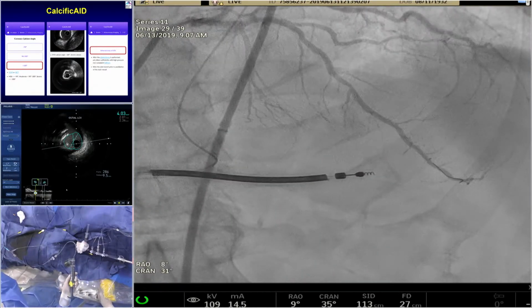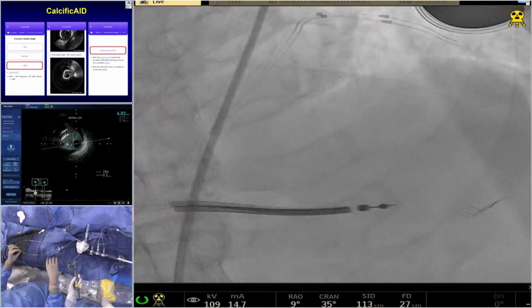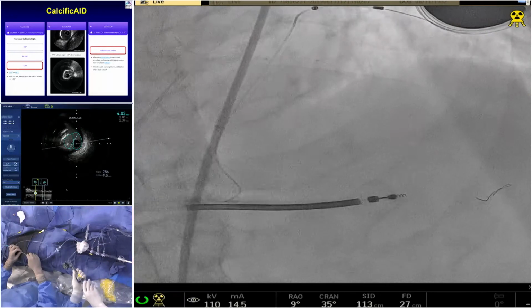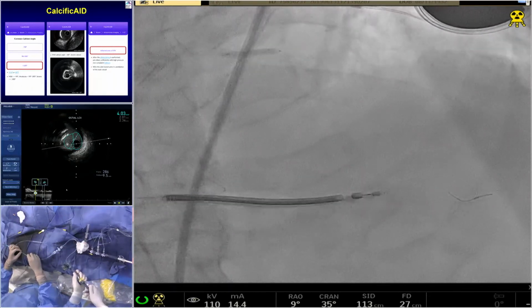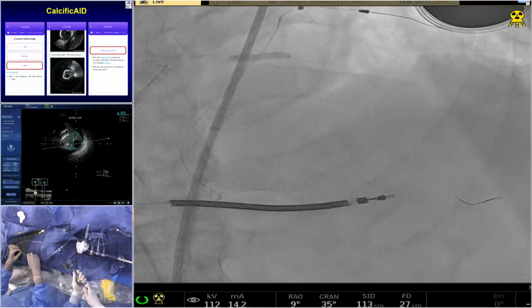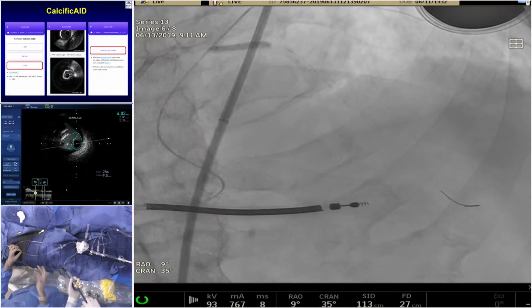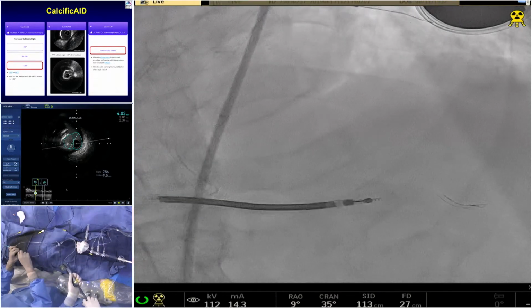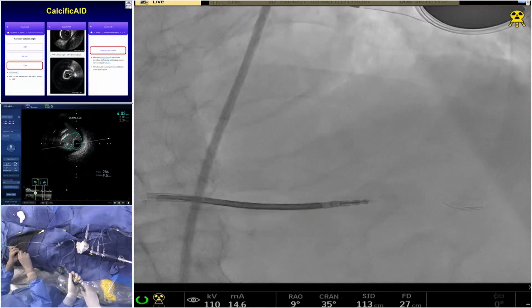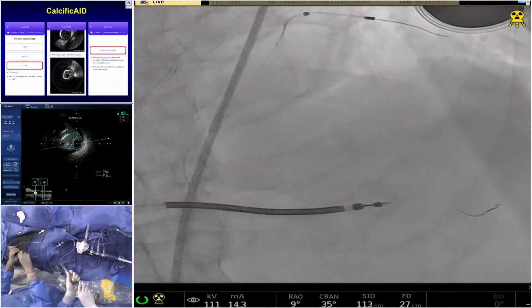As I said, I will dilate the LAD, the left main and the circ, maybe with cutting balloon for the left main, and then decide after I see the result of predilatation. But I have a very high threshold to stent the ostium of the circ. Even if there really is a dissection, I do IVUS and decide.